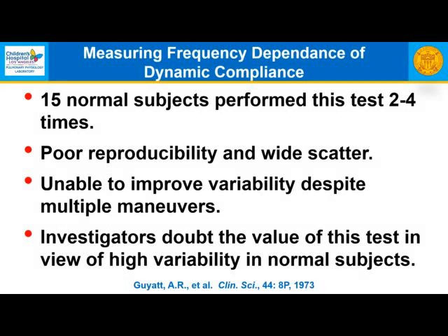And to be honest with you, I really haven't seen examples of this test being used in the last several decades. So, well, it was an interesting idea, and there were some preliminary effects, I think, for the average laboratory to try and produce this with any reproducibility is unlikely. So this is a test that is of historical interest, but we'll probably never use.